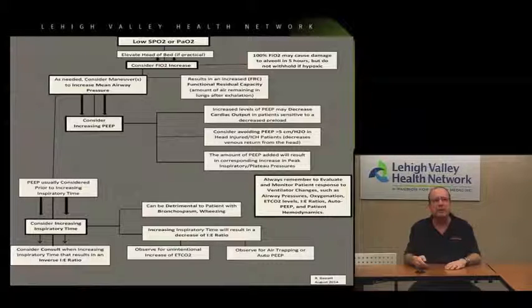Now the amount of PEEP that you add is also going to add to your airway pressures. It's going to add to your peak inspiratory pressures, and more importantly, it's going to add to your plateau pressures. So you want to keep that in mind. If you have a patient that already has plateau pressures of, let's say, for example, 35 centimeters of water pressure, and now you're throwing 10 more of PEEP on, well now it's going to be up around 45, and there's a chance you're going to set up that patient for an acute lung injury, or maybe increase their likelihood of developing ARDS if they haven't already. So sometimes you need to trade off, but that's something you want to keep in mind.